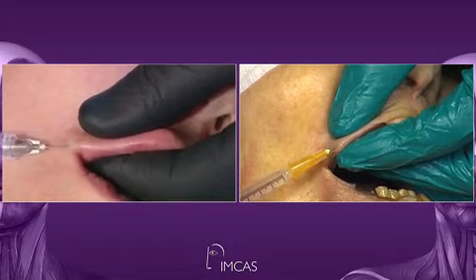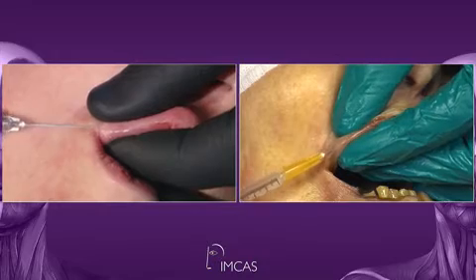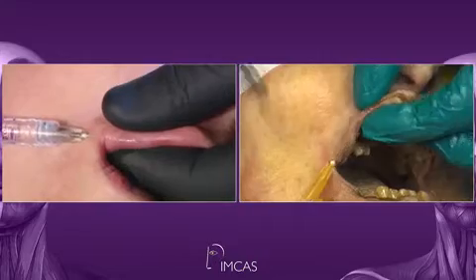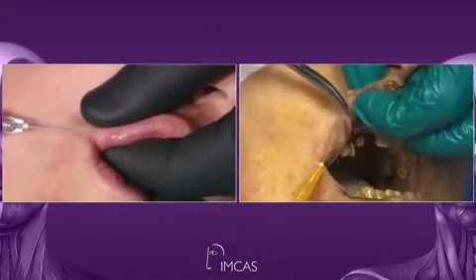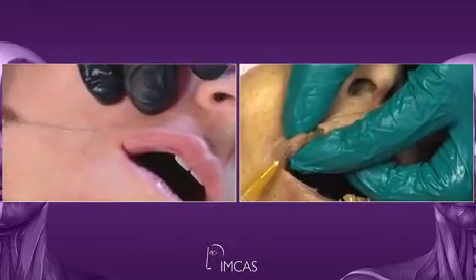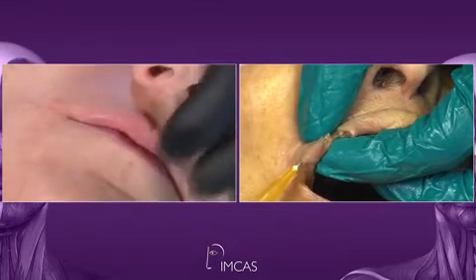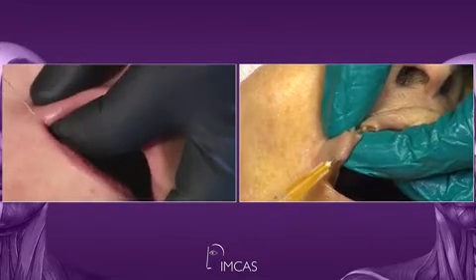I normally do retrograde injection. I think working with cannulas, of course, gives better control. I know some like push ahead because it's numb as we come, but move it gently and it's not too painful. So that's just the lateral part of the upper lip to evert it. But of course, always treat upper and lower lip.